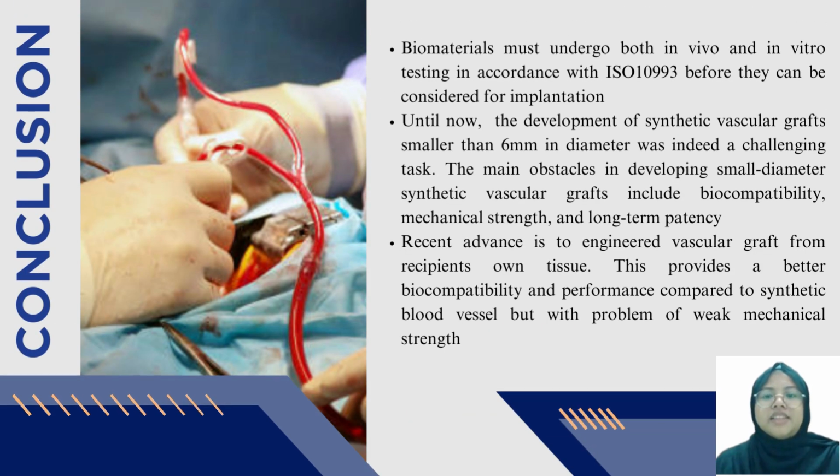All materials must undergo in vivo and in vitro testing according to ISO 10993 to ensure that the material is biocompatible before using. The main obstacles in biotechnology are biocompatibility, mechanical strength, and long-term patency. The engineering of vascular grafts from the recipient's own tissue has been introduced, which has better biocompatibility and performance than synthetic blood vessels, but has the problem of poor mechanical strength. Maybe it can be developed further with the help of more advanced technology in the future.